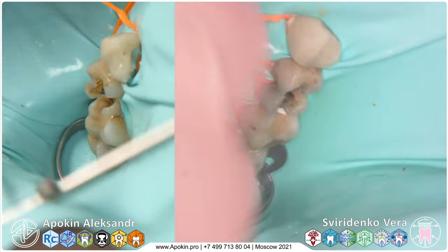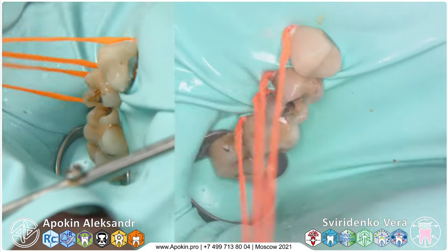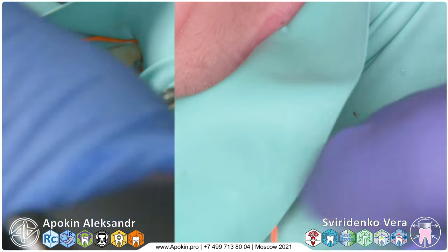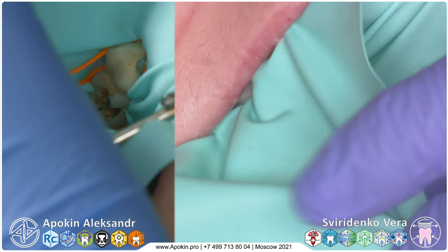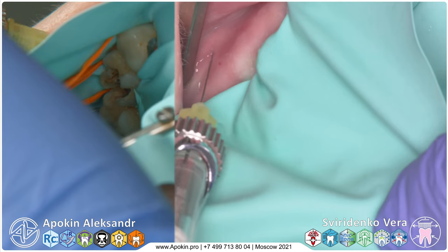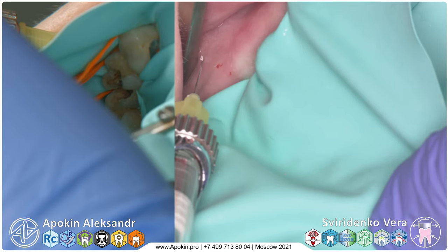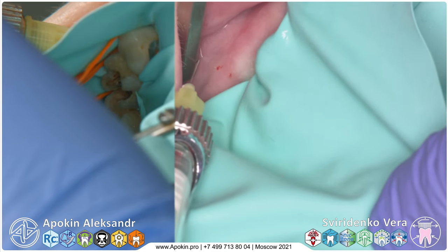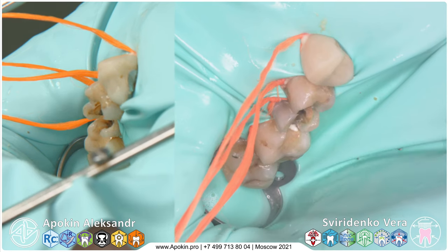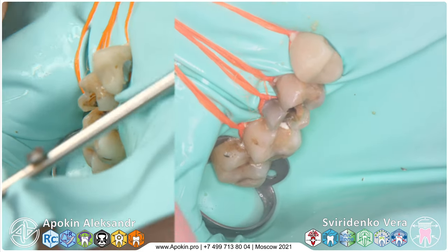Also, we fix these ligatures the same way, but I decided to expand the area of working, and today I made additional infiltration anesthesia in the area of 16. We remove some part of rubber dam and insert our needle in soft tissues. So you see that the rubber dam is not a problem to make additional anesthesia in any part you want during your treatment.